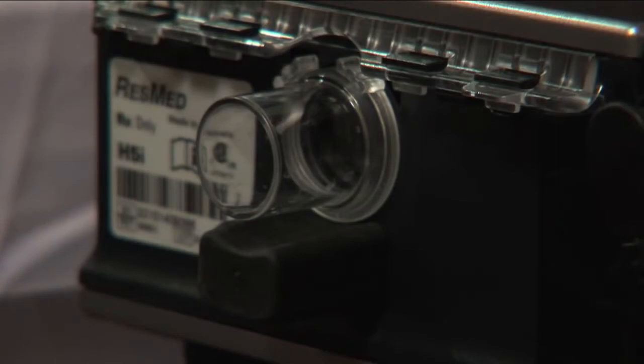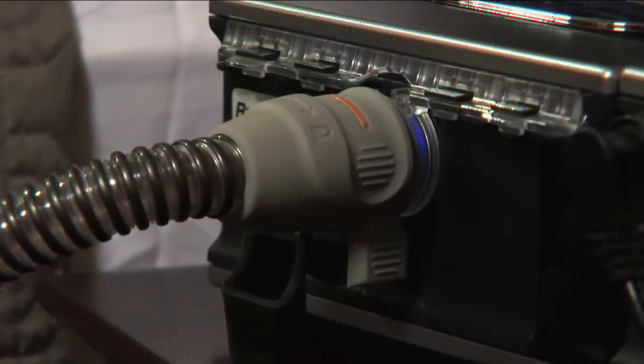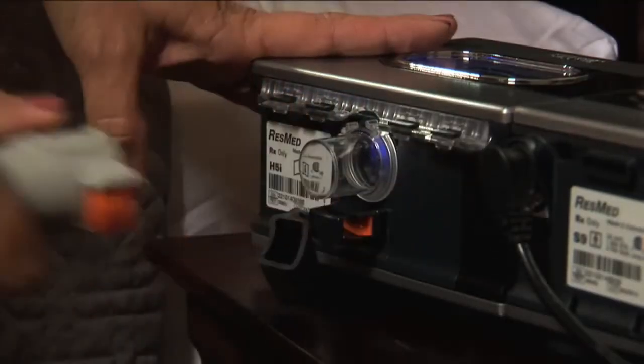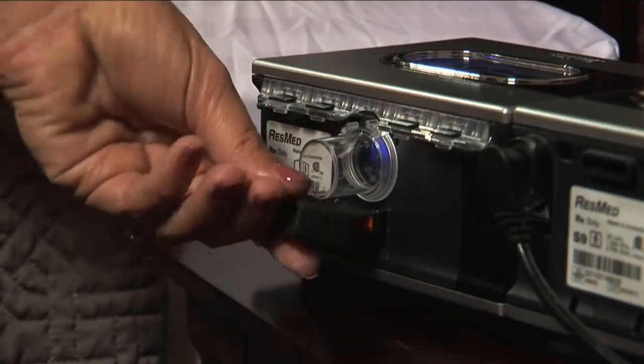To remove a heated hose from the back of your device, rotate the coupling counter-clockwise from the 6 o'clock position to the 3 o'clock position, and then pull the hose off the device.